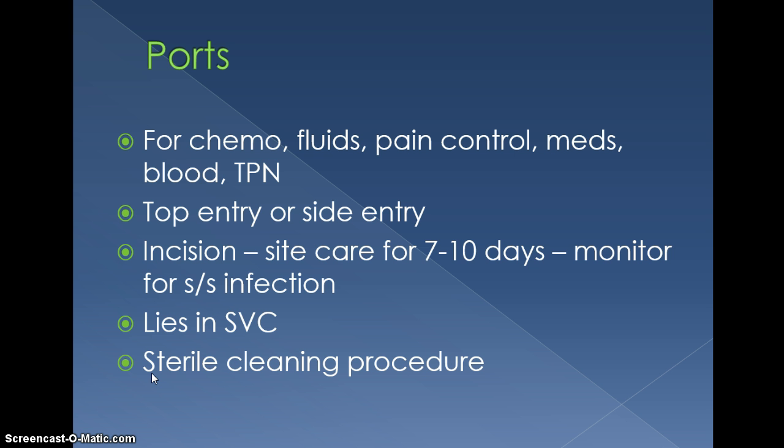There is an incision, so that must be monitored for 7 to 10 days for signs and symptoms of infection. Any of these procedures for a central venous access insertion do require consent because it is an invasive procedure.